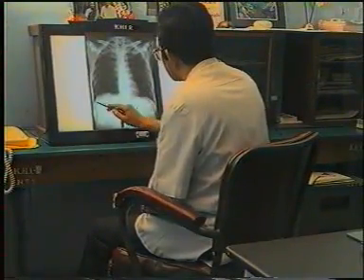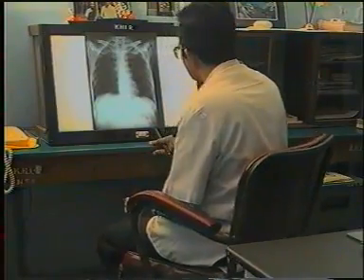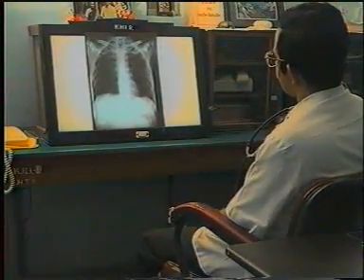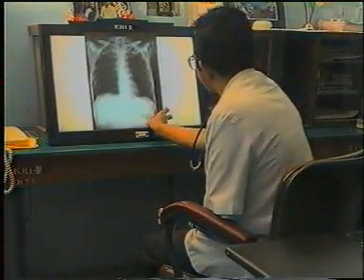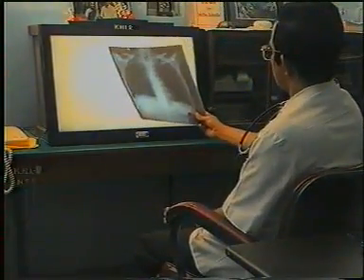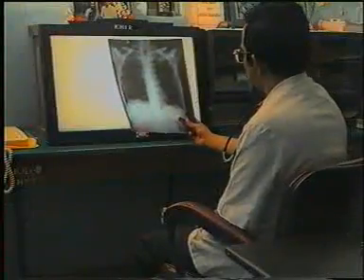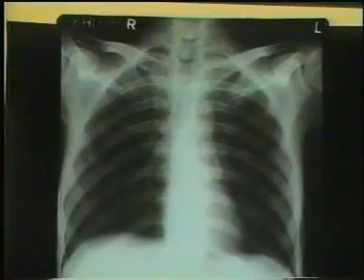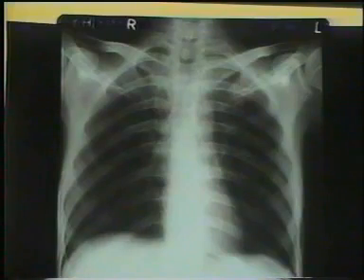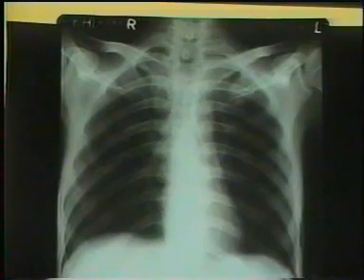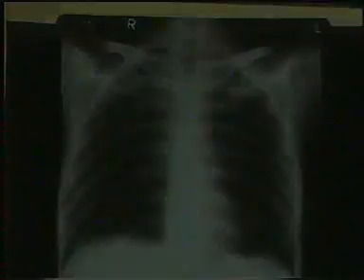After studying all these minute details, it is very important to stand at a distance and look at the film as a whole, because many times a close and minute inspection may miss a gross change. Then hold the film at an angle and view it slightly tangentially. Minor changes in radiolucency of the lungs are better appreciated this way. This completes the study of an x-ray of the chest. Over the years, with experience, you become so familiar with the normal structures that a change will be recognized at a glance. But a good practitioner will never call an x-ray as normal at a glance. Even the most experienced radiologist will study the film systematically and minutely before giving it to you.